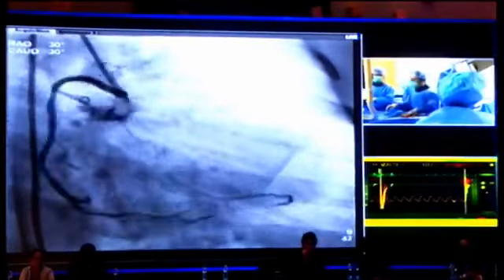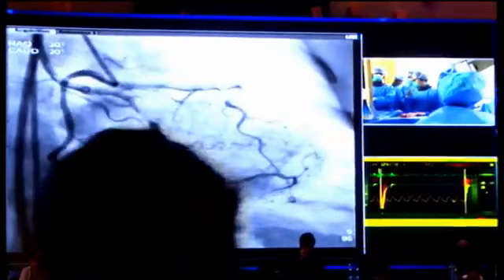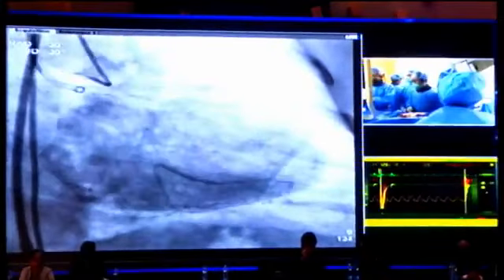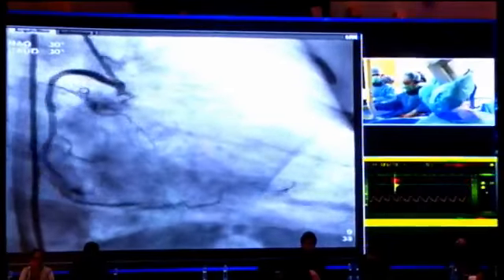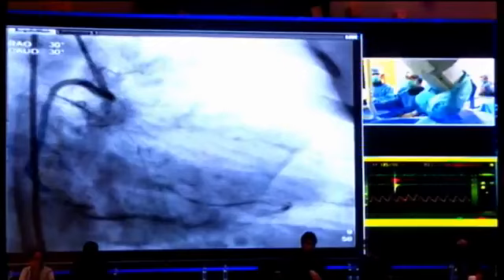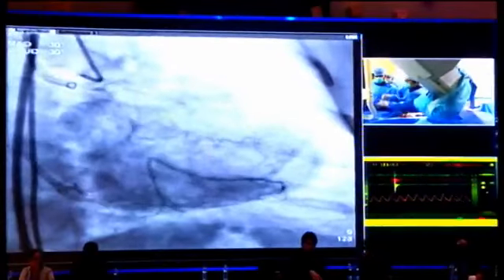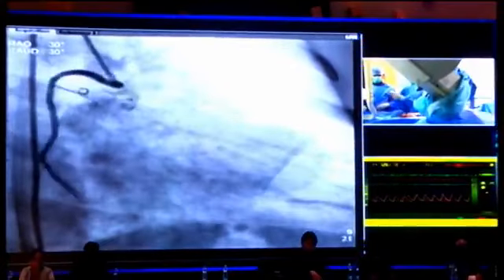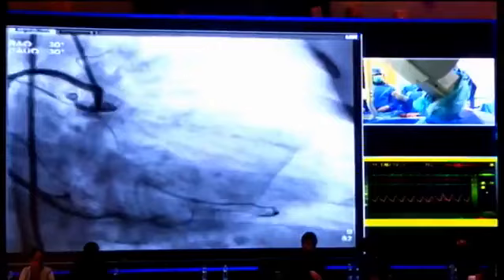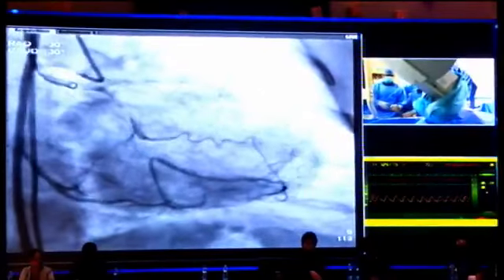The anatomical challenges here: one is the ambiguous cap. Spider view, please. And please give me the balloon again. The cap ends at the bifurcation, and I would like to check the length from the other distal angle. One more thing is that before the proximal cap, the segment is so aneurysmal, almost dilated, so pointing the guide wire towards the proximal cap is a bit challenging.